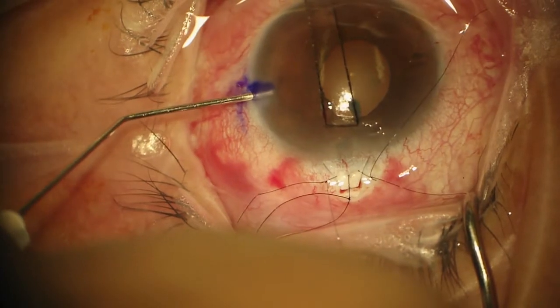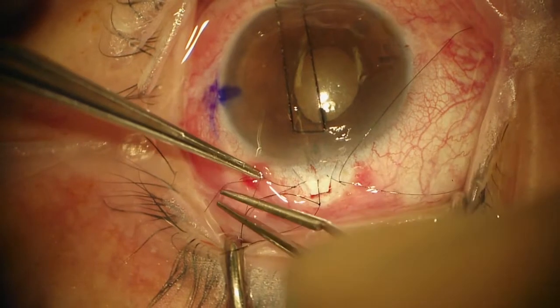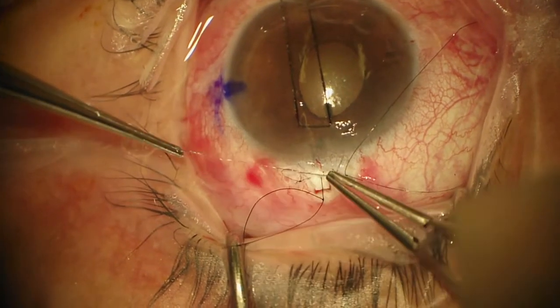We're going to take some BSS again. Now we'll tie them down — two ties please. Try not to change the tension on the suture.